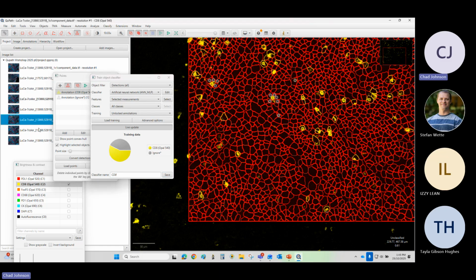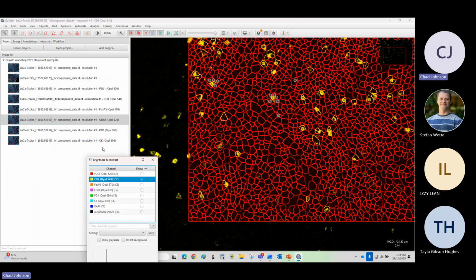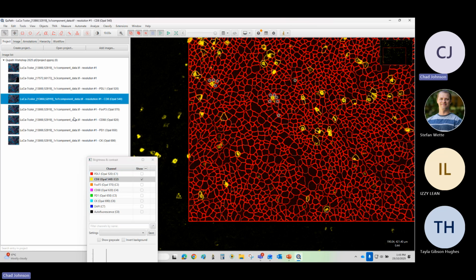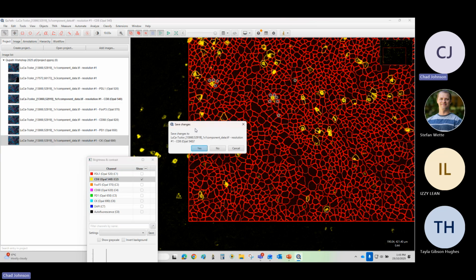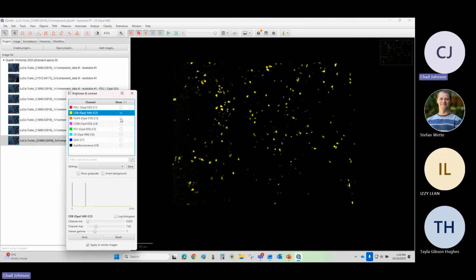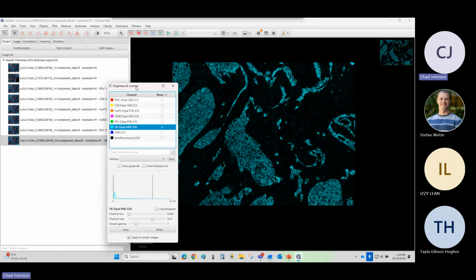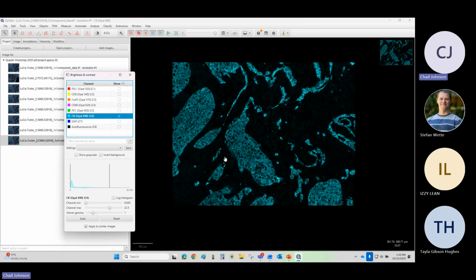All right, so I'm going to close these, and now I'm going to go from CD8 to another channel. I'm going to go to CK, which is the blue channel. So do I want to save the changes? Yes, you want to save those changes. Now, the same channel's being turned on, so I'm going to turn that off, and I'm going to turn on the CK channel so I can see the specific channel that I'm looking at.